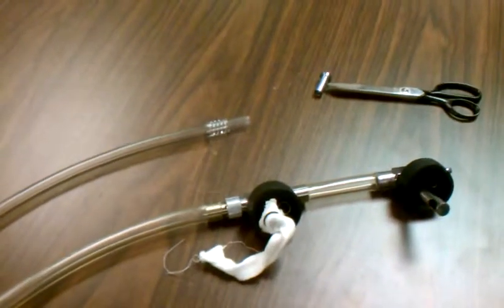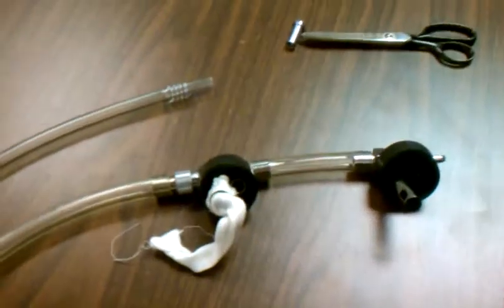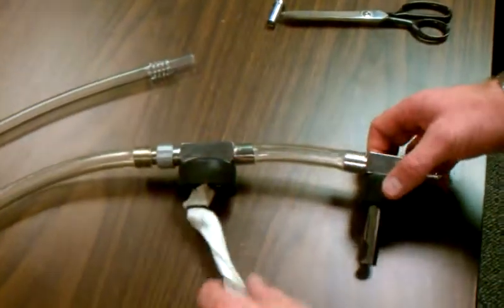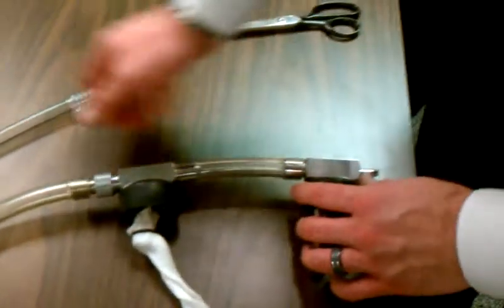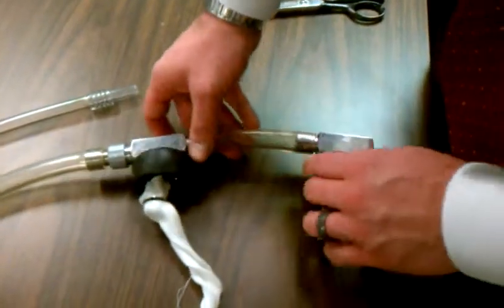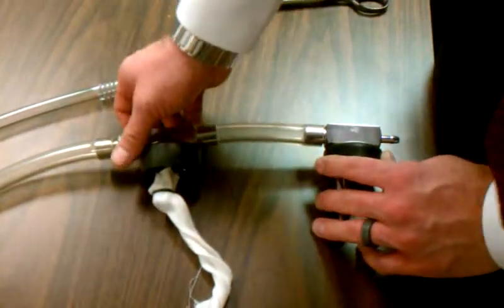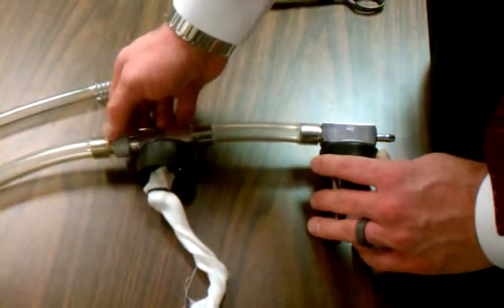What we're going to do here is show how to adapt the tubing set on this Gomco so that you can use a disposable tubing. As you can see, from the factory it comes with the larger tubing, which is set up for a reusable curette.